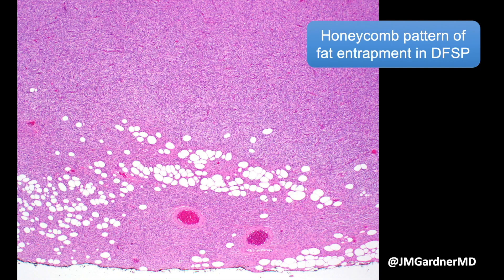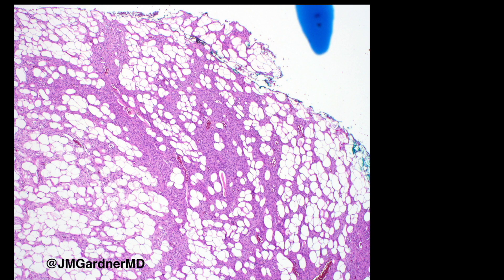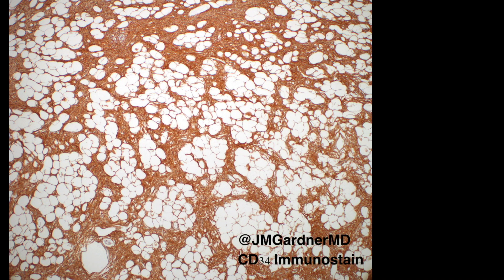Sometimes the subcutis gets completely overrun by tumor, and all you'll see is a tiny bit of fat trapping while the rest looks like solid storiform bland spindle cells. I remember being confused by this in fellowship, but Dr. Weiss explained it's because the tumor has grown all the way to the edge and replaced all the fat. I see this scenario most often in scalp tumors, where the tumor grows down to the galea or periosteum, hits a wall, spreads out laterally, and replaces all the fat except for a tiny remnant.